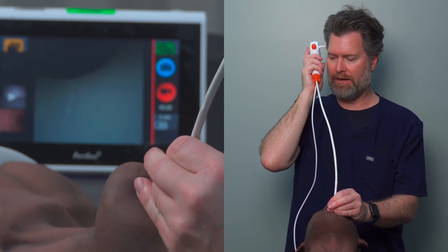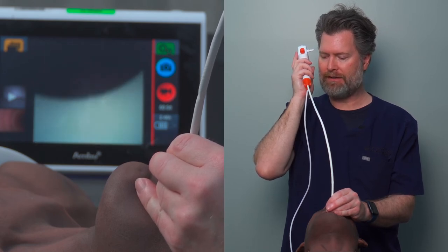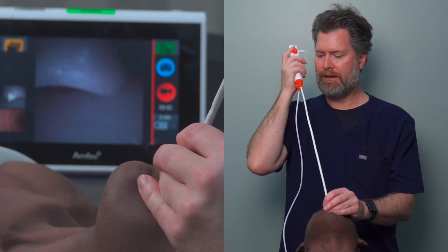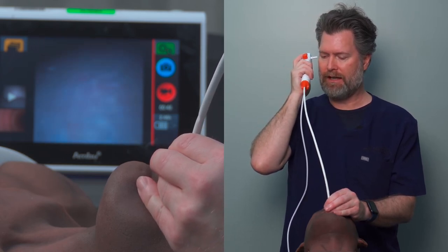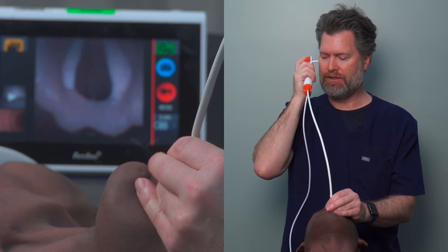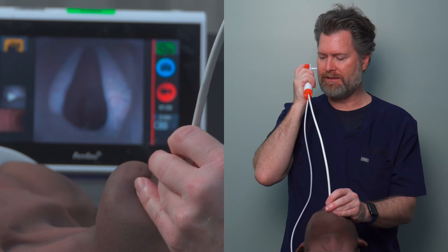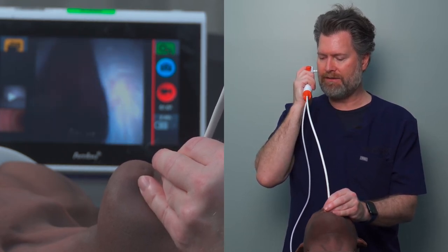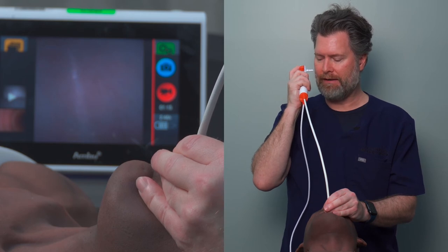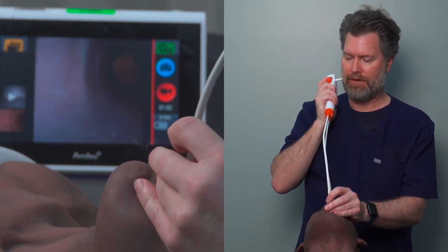The ramp looks like a ski jump and takes you all the way down. There — you see the lip of the Williams Airway, and then as I advance slowly forward, you can actually just see that epiglottis come into view. Now I'm going to slowly inch my way forward — I'll have to drop down just a little bit to get underneath the epiglottis, advance a little more, and then once I'm a few millimeters past, I push the lever down to look up. I can see a great view: the arytenoids, the vocal cords, tracheal rings in the distance. With fine micro adjustments, I advance toward the anterior trachea, get a nice close-up view, then push the lever up to drive the scope down into the anterior trachea and down to the carina.